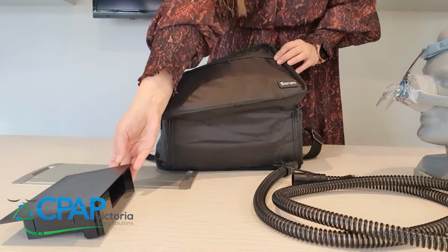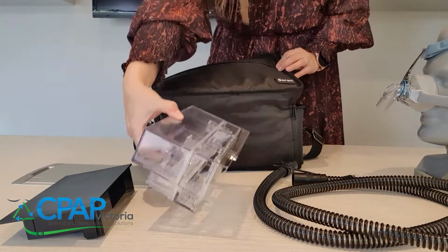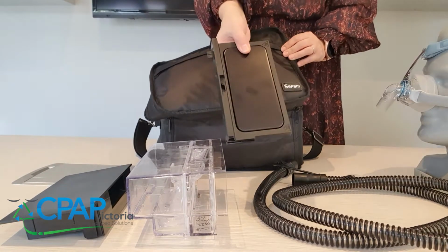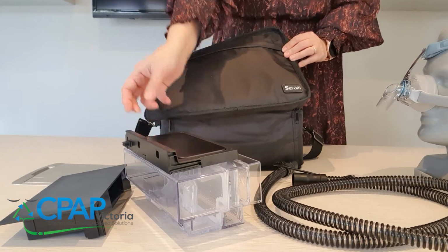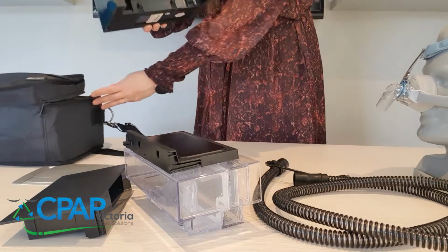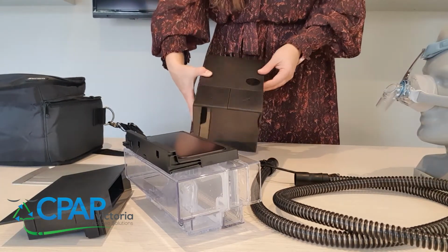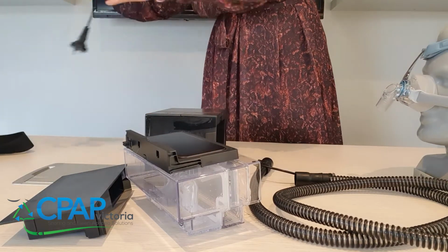Next, we will see the humidification tub or chamber. Next is the humidification plate or heated plate. Then you will find the CPAP pump itself. And also the power supply unit for the device.